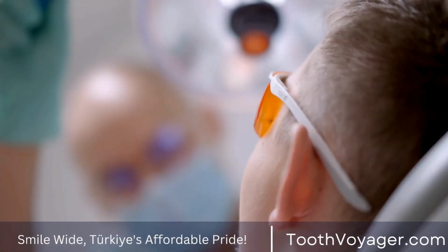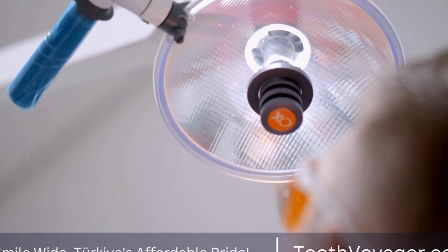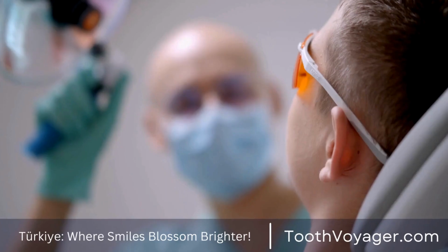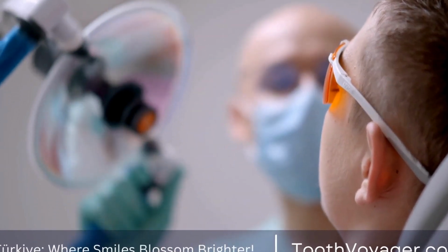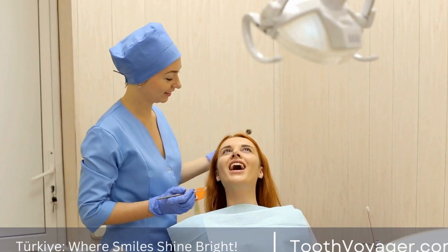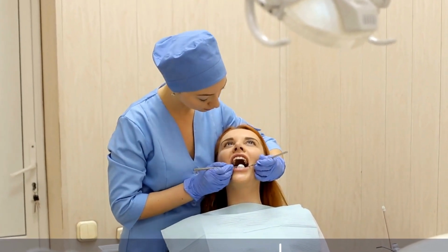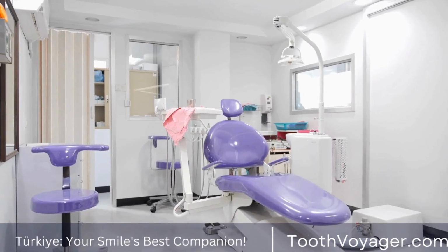During the procedure, the dentist or oral surgeon will make an incision in the gum tissue and place the bone graft material into the area of bone loss. The graft material may be covered with a membrane to protect it and promote healing. Over time, the patient's body will naturally integrate the new bone tissue into the existing jawbone, creating a strong and stable foundation for implants.